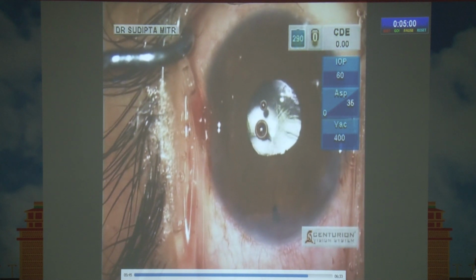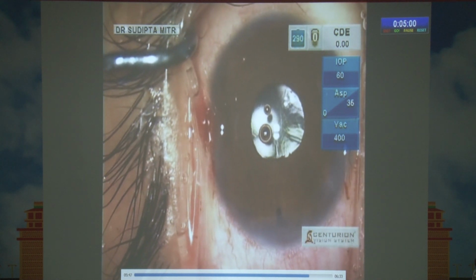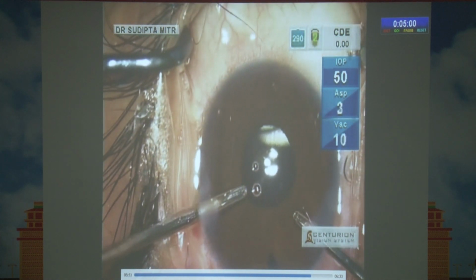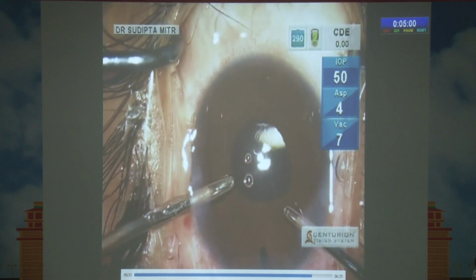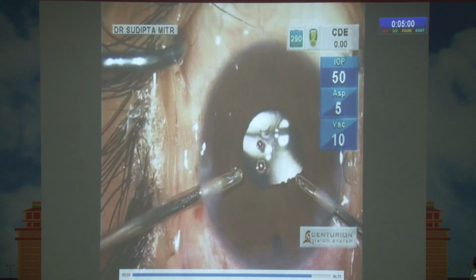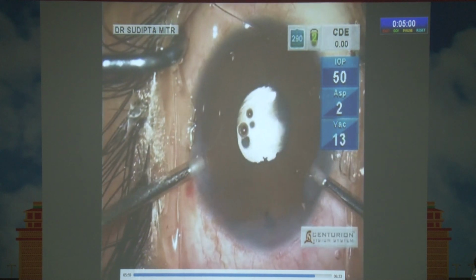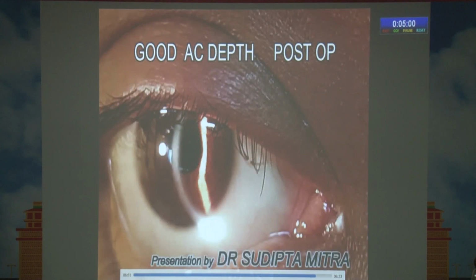The patient was in topical, by the way, because I wanted to ensure the Purkinje images. The patient was extremely cooperative with me, I must say. And after a very thorough wash, so this was the post-op.